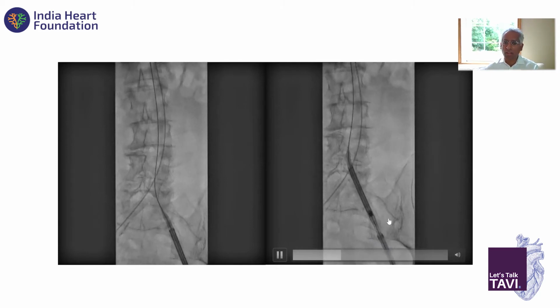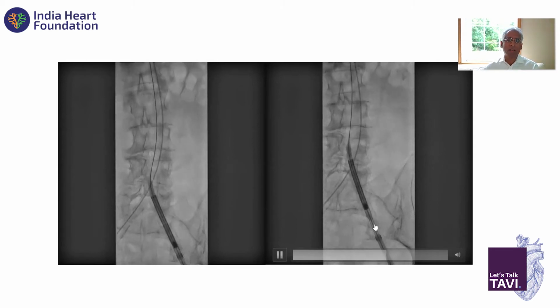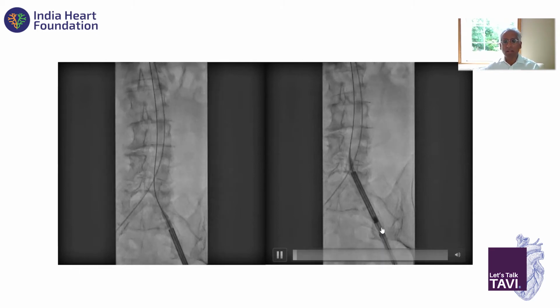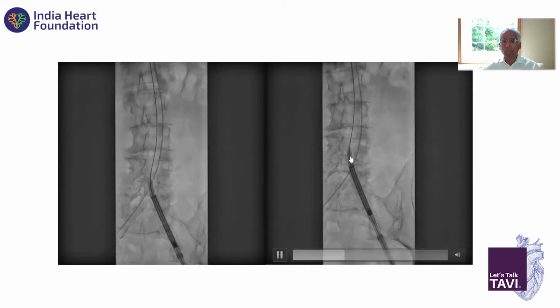Jig it is a very Northern Ireland statement. It means you're trying to, almost like a vibration effect, or the other analogy I gave is like a salmon trying to swim up against the current. You're jigging it a little bit, and you're just essentially moving the delivery system left and right very rigorously, but not twisting it too much. And it just does not want to go. It goes a little bit.